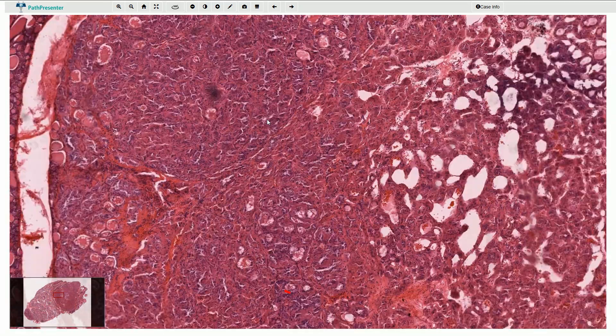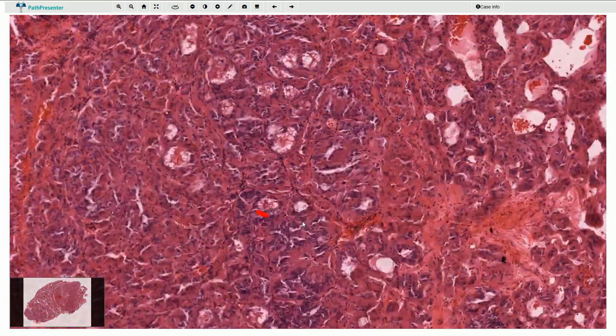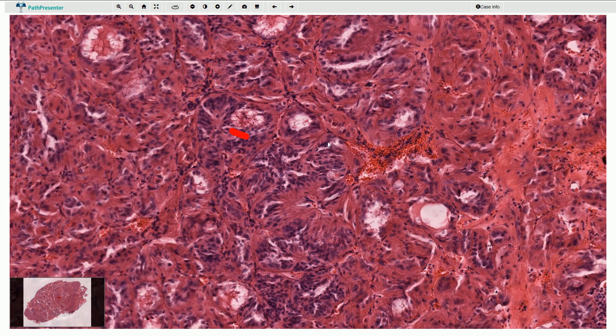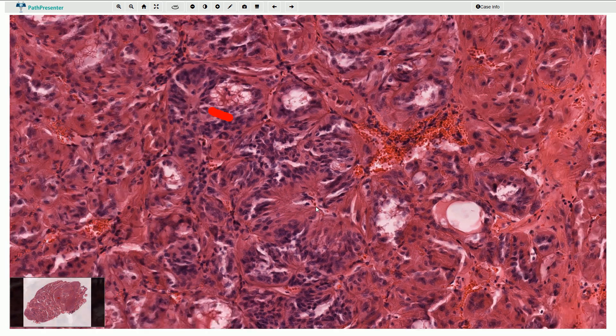On higher magnification we can see that the tumor is composed of small cellular nests, and around these nests we can see very thin fibrovascular septa.